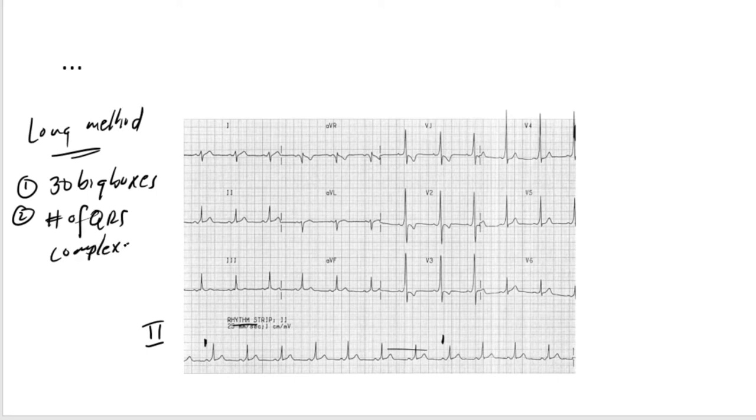Then the second thing that you want to do is count the number of QRS complexes in those 30 boxes. So between here and here, how many QRS complexes do we have? We have one, we have two, we have three, we have four, we have five, we have six, we have seven. Then that number you multiply it by 10, and then you get 70 beats per minute.